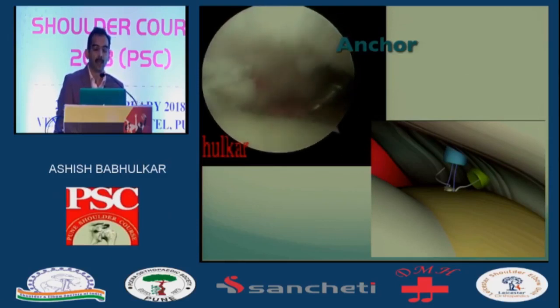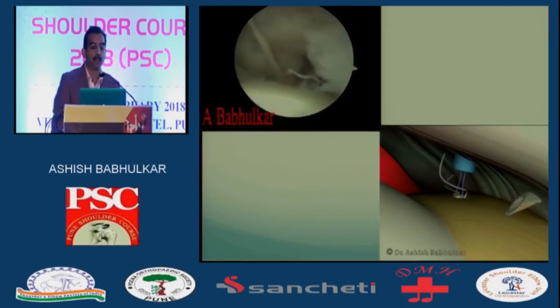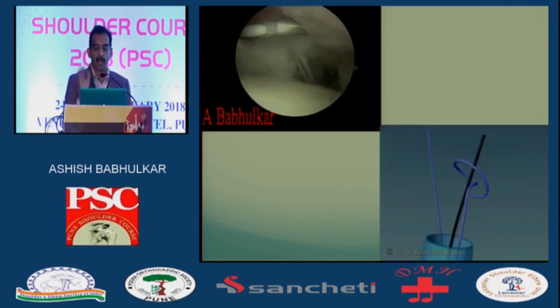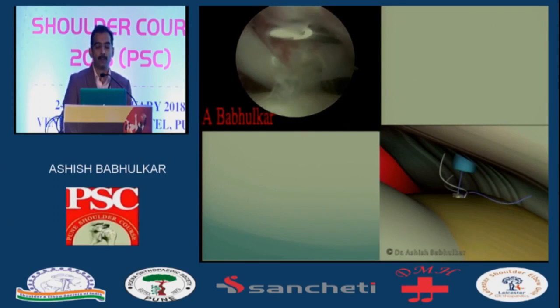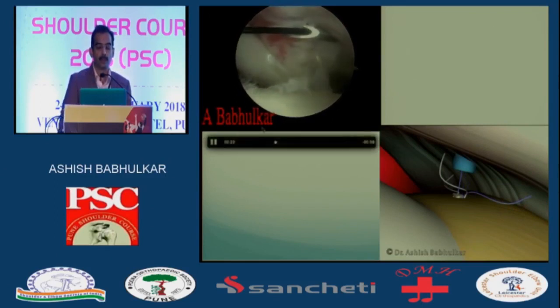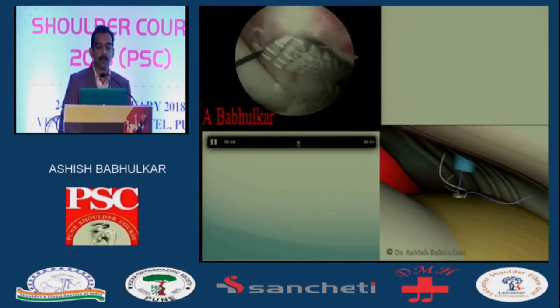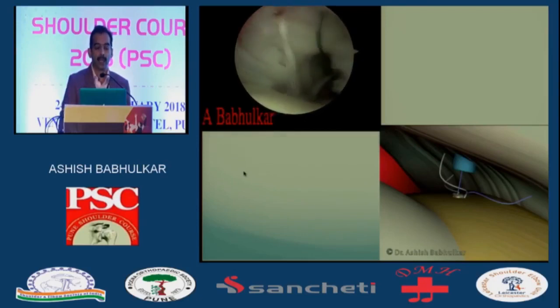Once we've inserted the anchor, we've got 4 sutures inside. We go in and separate the two sutures so that you don't get them mixed up. Pass in a needle, remove the stilet, and pass in the Ethylon. Ethylon works well — it goes through your typical needle that you use in your arthroscopy. Once you've passed your Ethylon through, you retrieve that suture, then do a suture shuttle so that you can pull it out, tie the actual suture onto that, and do the shuttle.